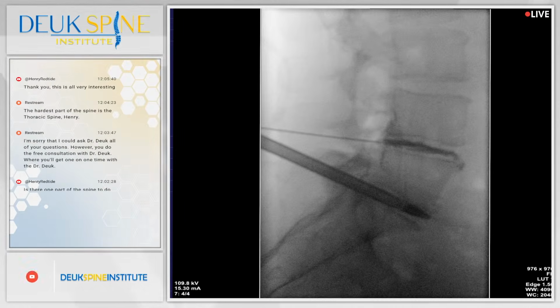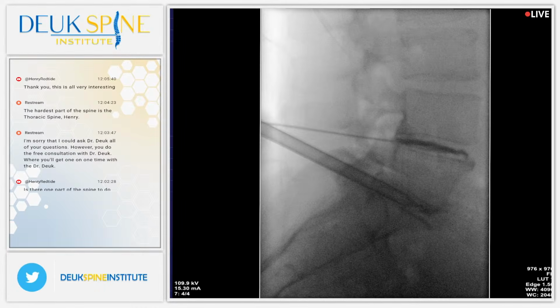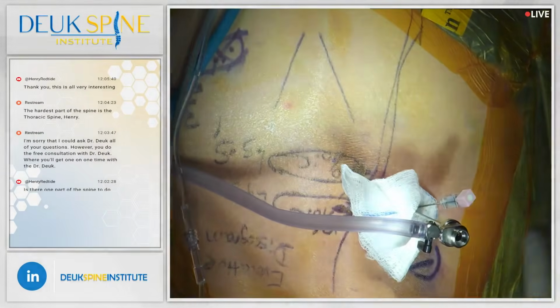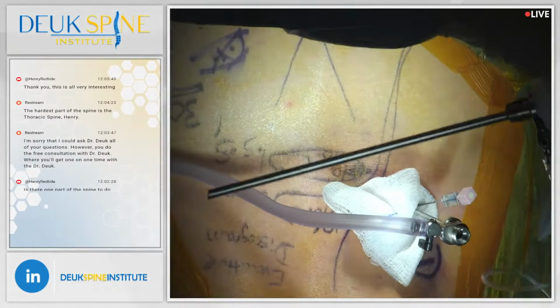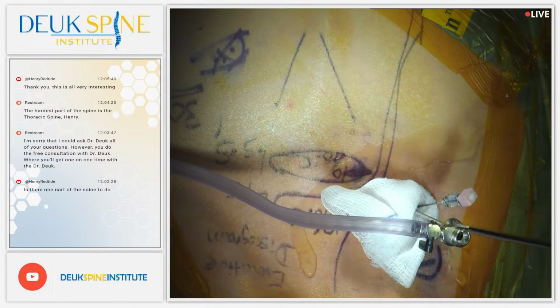Go ahead. Shot. So we got the dilator out. What's left is our tube. And we're going to do the entire surgery through a 7 millimeter or 1/4 inch tube right there. There's no need to open her back up like other doctors do. There's no need to do laminectomy and take the normal bones out of her spine. There's no need to take ligaments out that are good ligaments that are working, helping keep her spine together and stable like other doctors do. We are going to leave all of that alone.